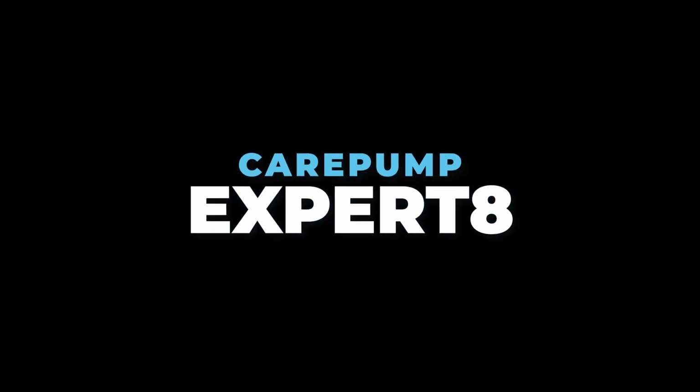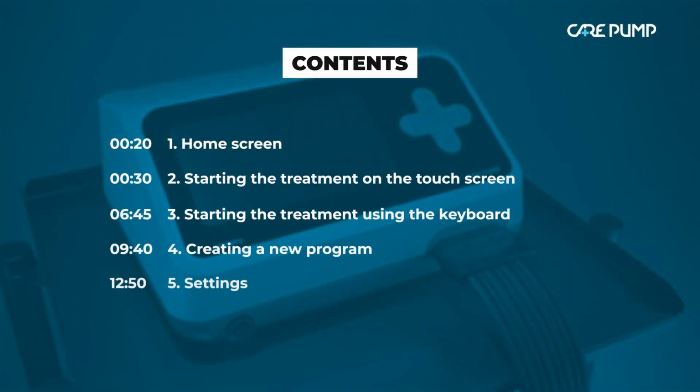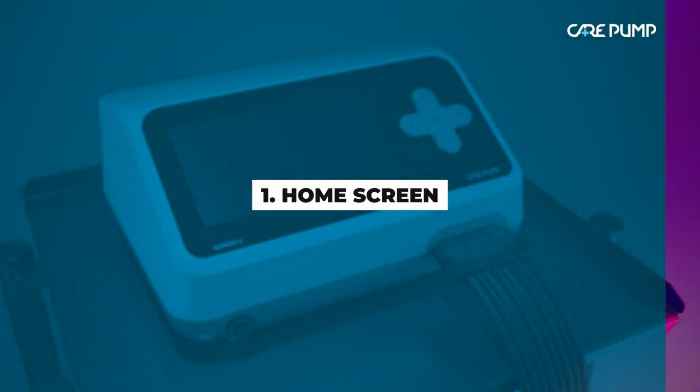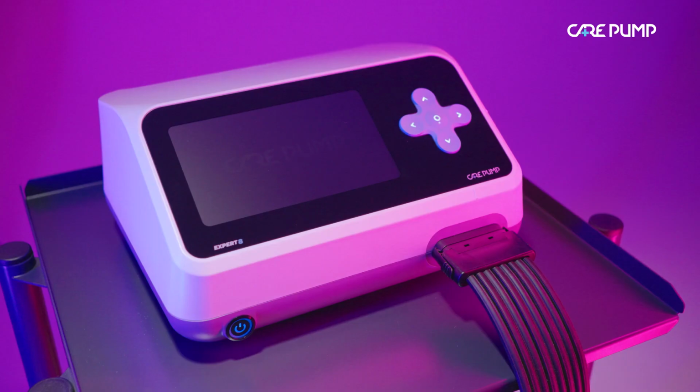Operation of CarePump Advanced Series based on EXPERT8 device as an example. Home screen. Start the device by pressing the power button. The home screen will appear.